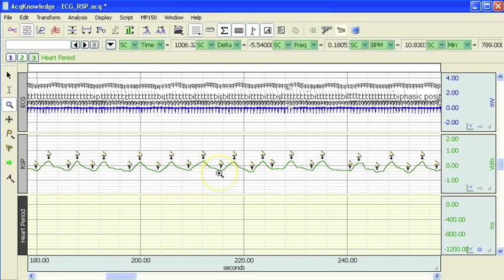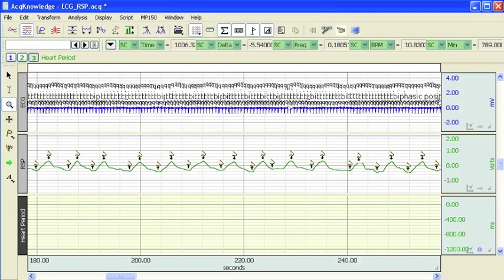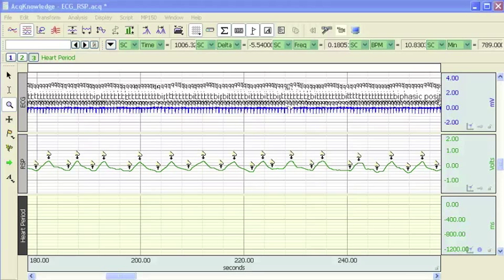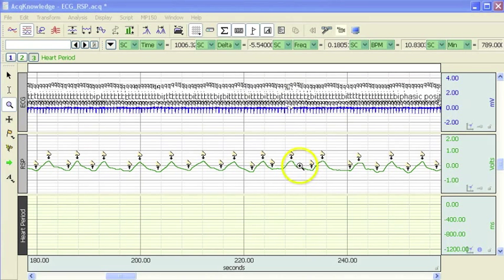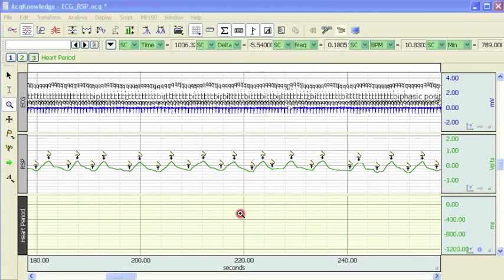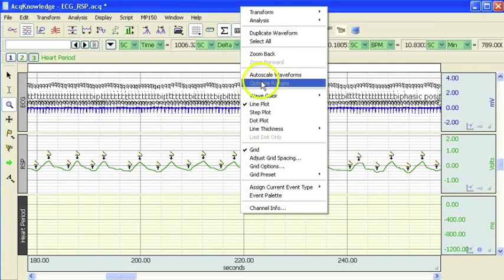That is important for this particular analysis because during the inspiration cycle we are going to look for the minimum R2R interval.